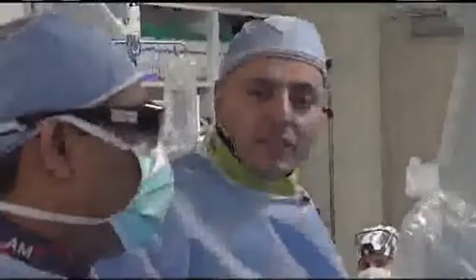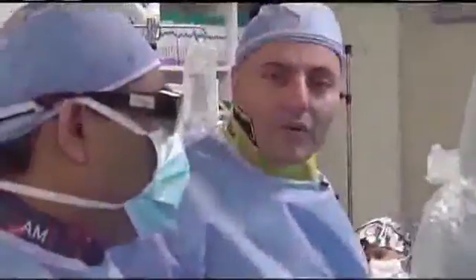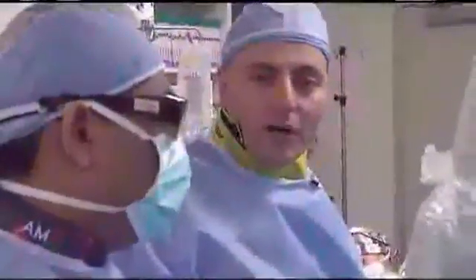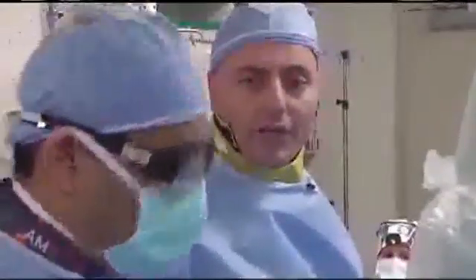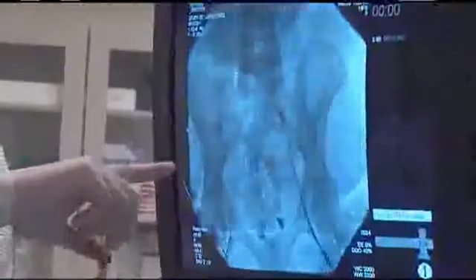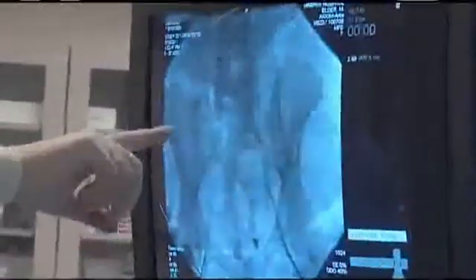We just did a digital subtraction, and I'm going to use overlay to mark our territory as I access the contralateral side with the chronic total occlusion of the iliac. As we use overlay, you can see an advantage to access the contralateral side into the right external iliac — it's off into a plane that is not luminal. It's right around the external, it's still luminal, and now there appears to be a dissection plane on the right external iliac.